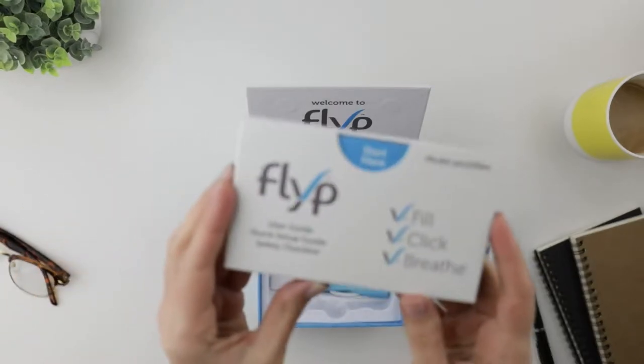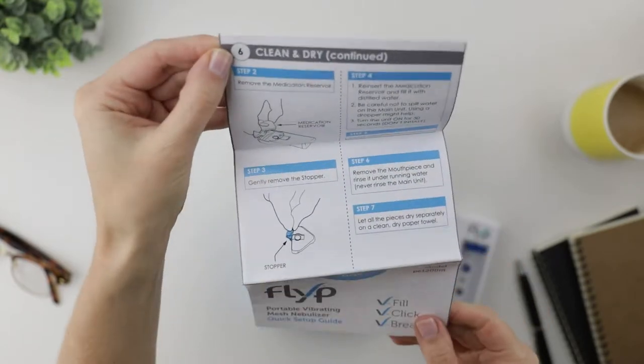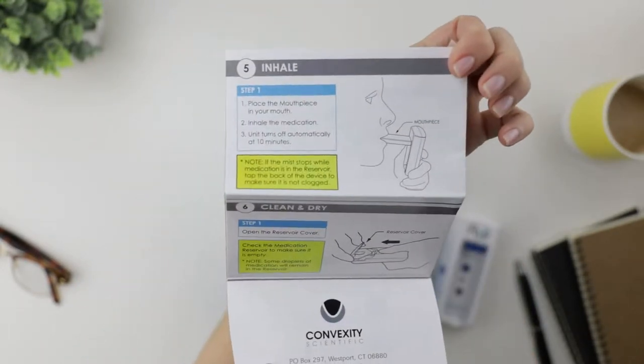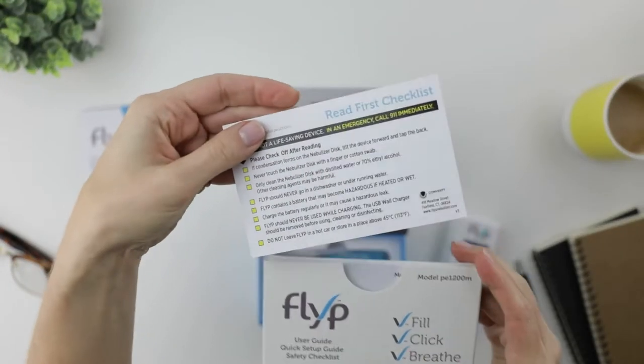Let's get back to this packet. We've got a quick setup guide, an overview — simple. I'm seeing a theme here. Inhale — I think I can handle that. And next we have helpful safety and cleaning tips on one little card.